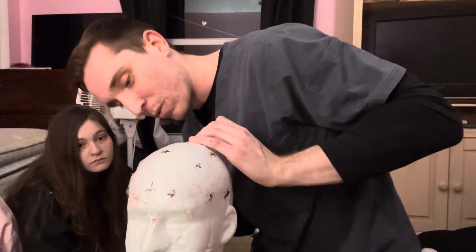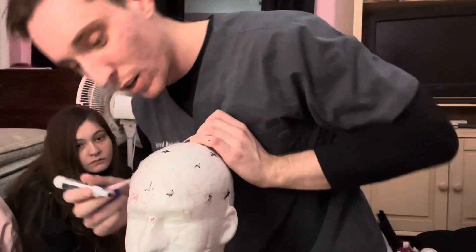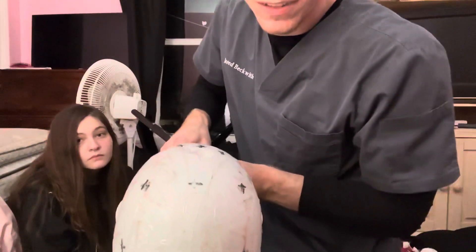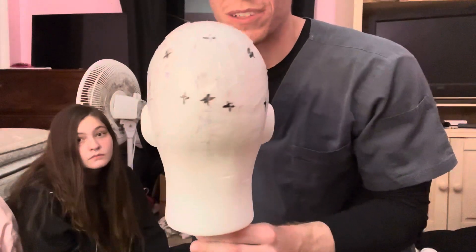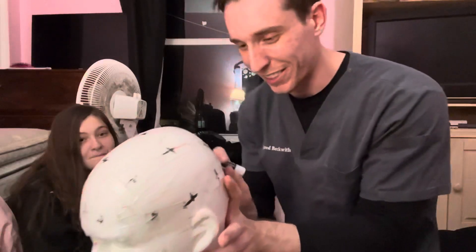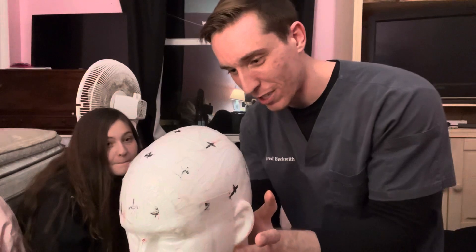Now we have the head fully marked and measured and ready for an EEG. Not too bad — this is a little off, but I'm trying to film a video and talk to you guys at the same time, so cut me some slack. It'll be a little more even in practice.